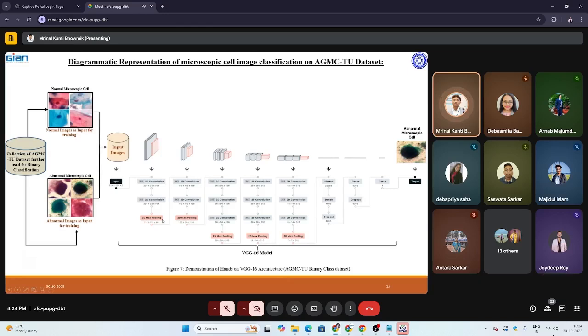I'll be explaining in detail what max pooling is doing here, what the convolution is, and how it is reducing the image size, the height and width. Here it is just an elaborate explanation of the architecture, which I have already previously explained, that is, how many convolution layers there are.